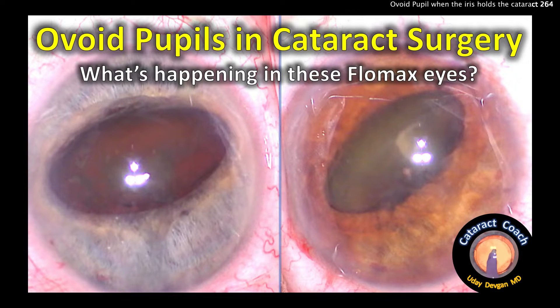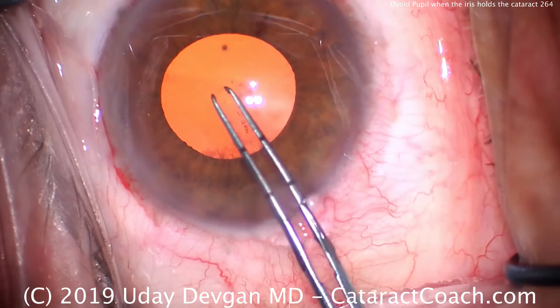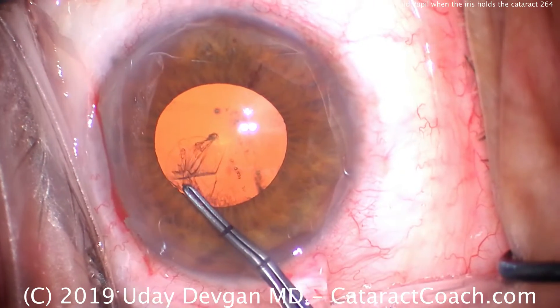From cataractcoach.com: what's happening in these Flomax eyes? Why is the pupil ovoid? That's actually a trick we use to have the iris help us by holding the cataract. So we're starting off our capsulorrhexis.